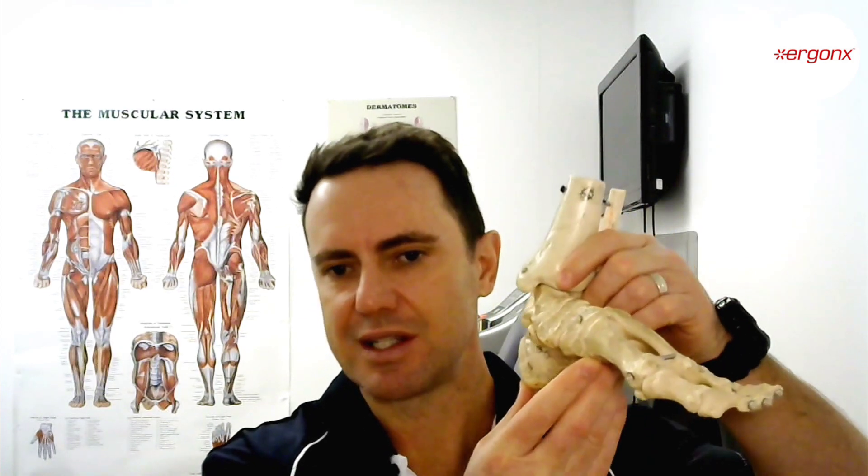We'll use overpronation as an example. This is a left foot here. Basically what happens in overpronation is the foot rolls towards the inside and the arch flattens out.